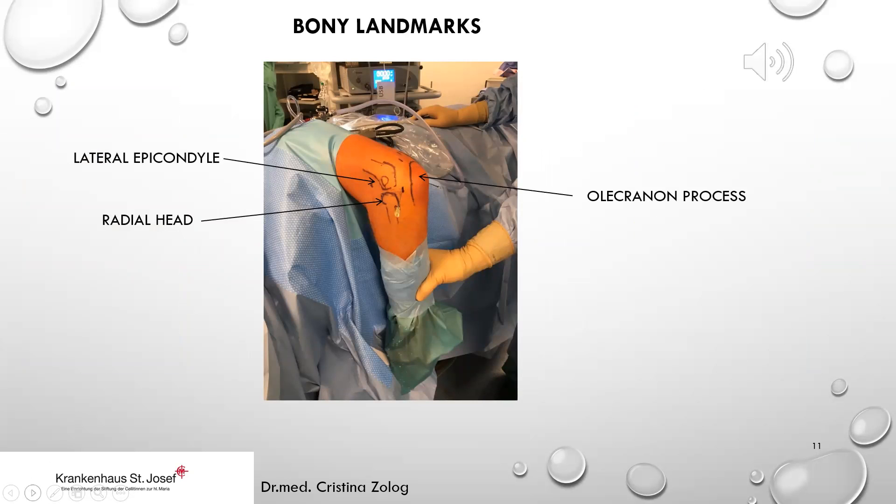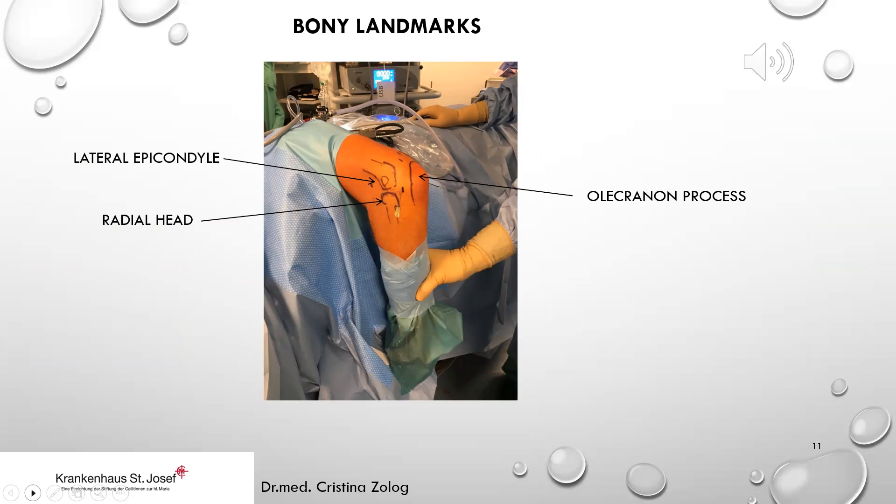Before we start with the arthroscopy, we mark the bony landmarks on the elbow. On the lateral part: the lateral epicondyle and the radial head. The olecranon process is in the middle of the elbow. On the medial side, it is important to mark the medial epicondyle and the ulnar nerve — palpate it to see if it dislocates.